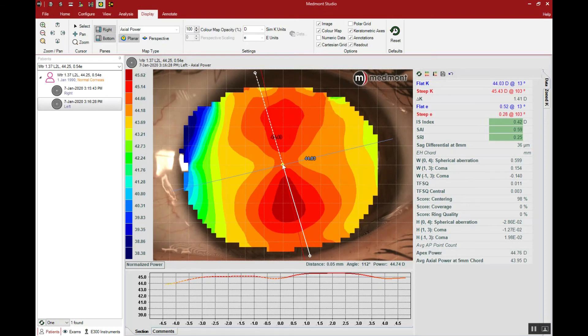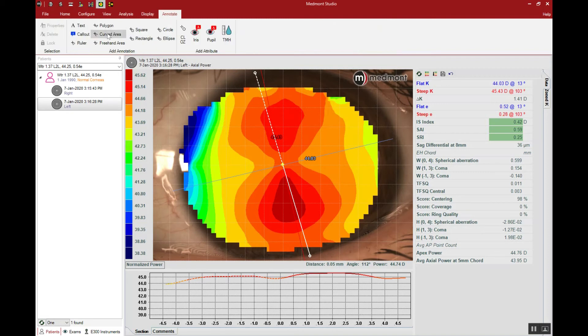Another consideration prior to building our orthokeratology lens is to measure the visible iris diameter so we can assure ourselves we have the correct custom lens diameter for this patient. Let's go up to annotate and grab our ruler. We'll click our cursor on one side of the cornea at the border between the visible iris and the sclera, then drag the cursor to the opposing side, finding that border between the visible iris and the white of the sclera. Our white-to-white measurement indicates an absolutely normal visible iris diameter of 11.83. Typically, orthokeratology lenses are chosen at approximately visible iris diameter minus 0.8, indicating we should need a custom lens diameter of approximately 11 millimeters, though each manufacturer is slightly different in the way they choose diameter.